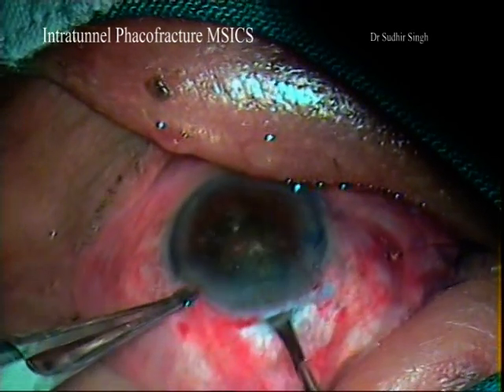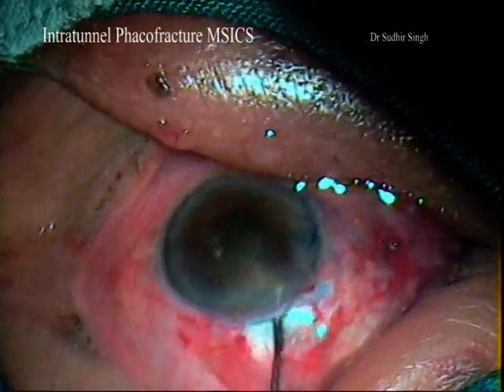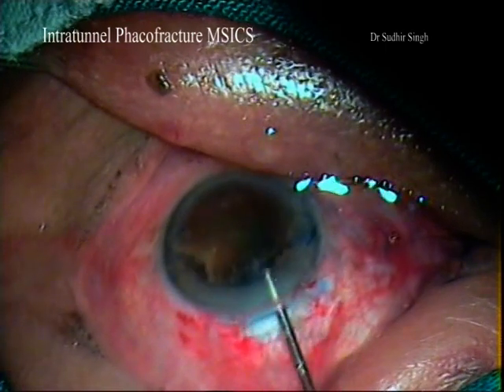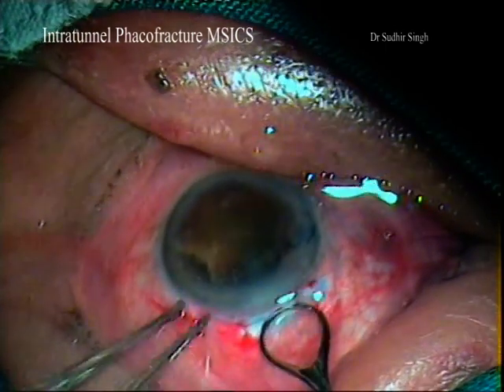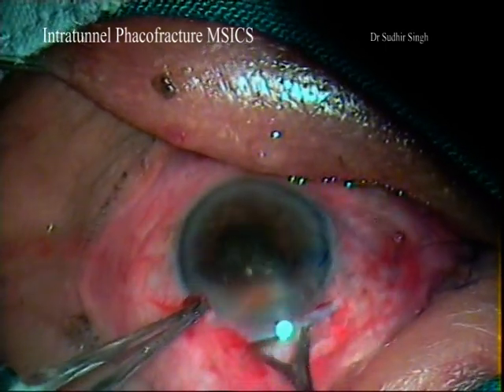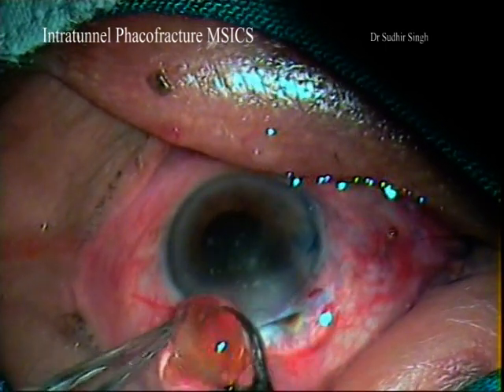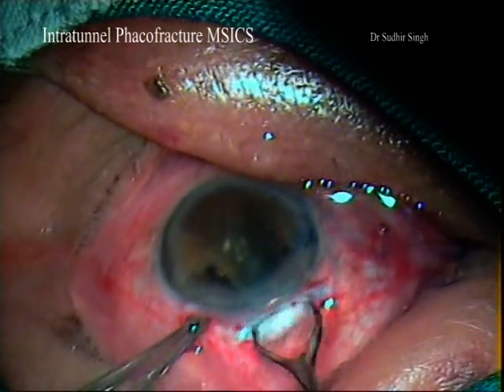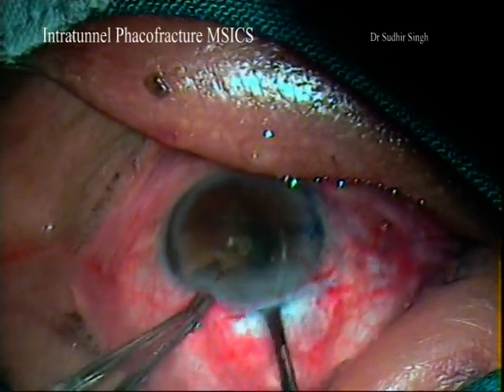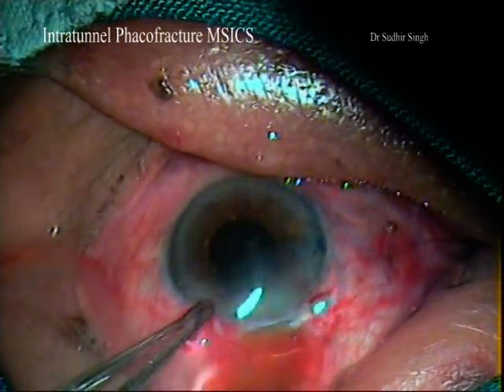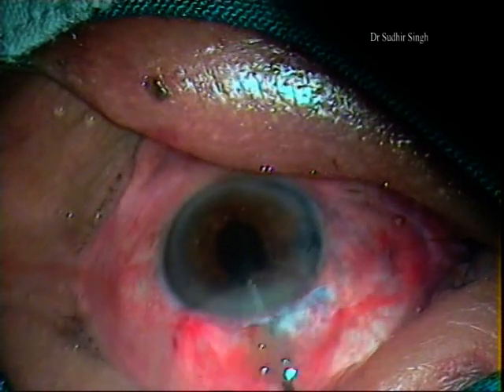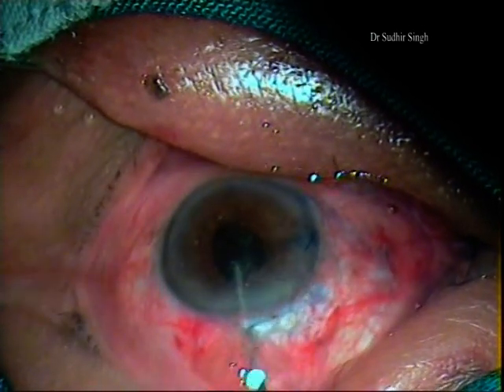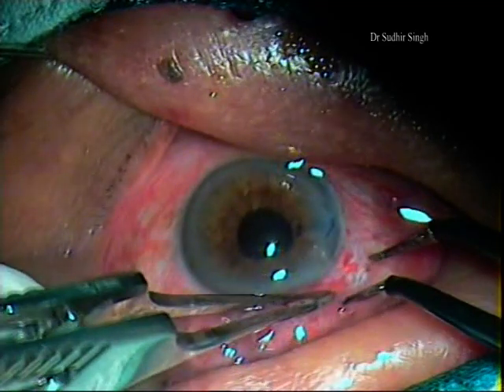The nucleus is managed by six millimeters intratunnel phaco fracture manual small incision cataract surgery, or any other nucleus management technique of the MSICS may be used as per the operating surgeon's choice. Cortical matter is cleaned by irrigation-aspiration cannula carefully, and a PMMA IOL is implanted.